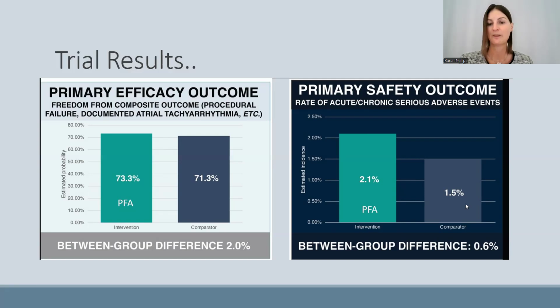Now, we'll talk a little bit more about this, but as I said, I keep coming back to safety. If people say that pulse field ablation is safer than the other type of ablation, well, there's lots to talk about with safety. As I said, there's no significant difference really between these two procedures, techniques, safety in the end. As I said, they have different types of safety issues, but we'll deep dive a little bit more into this safety on the next slide.